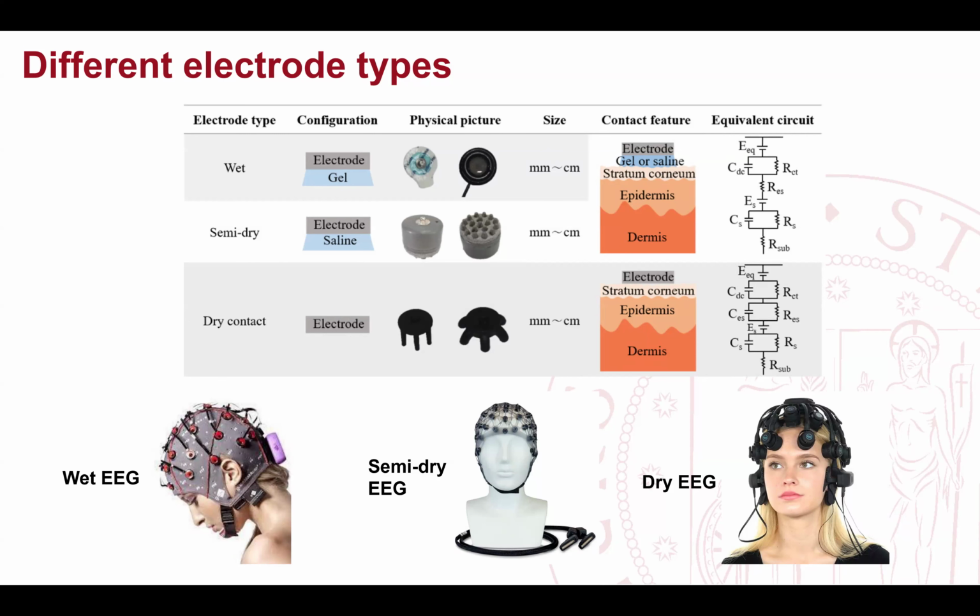These are the gold standard. If you want the best EEG signal, you need this type of cap, because it really allows recording the best possible signal.